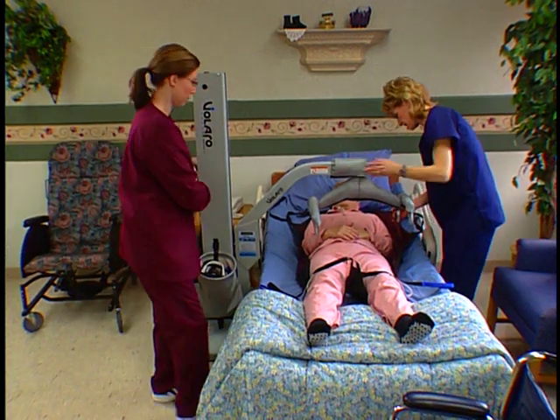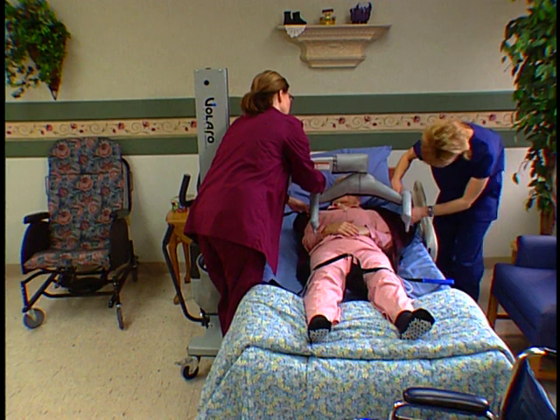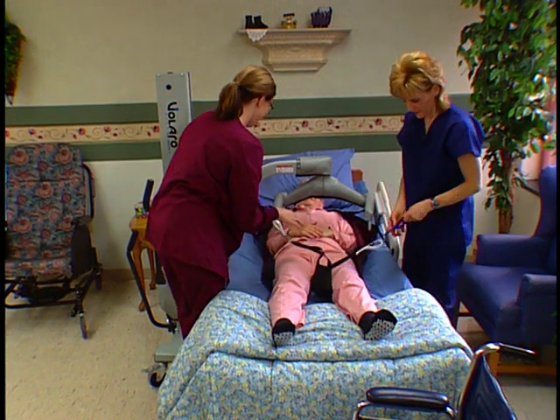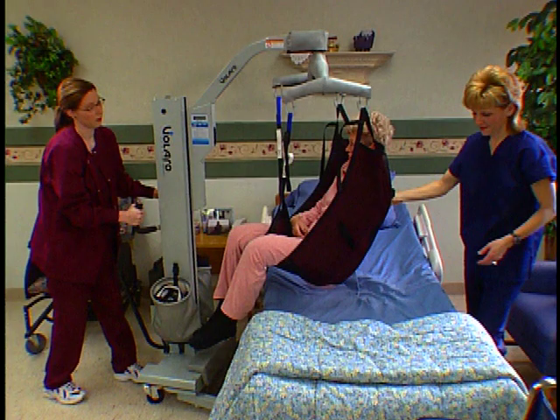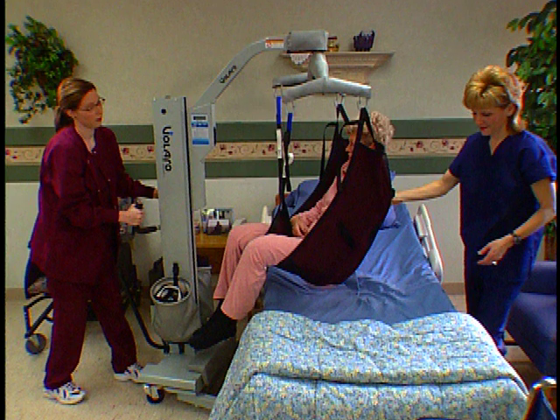Lower the hanger bar parallel with the resident until the hanger is low enough to hook up the loops on the sling. Attach the shoulder straps to the J-hooks on the hanger bar, then attach the lower loops on the sling to the J-hooks. Double-check your connections. Note: be sure to use the same color loops on the shoulder and lower straps when hooking the sling to the J-hooks. Either the shoulder or leg straps can be connected first.